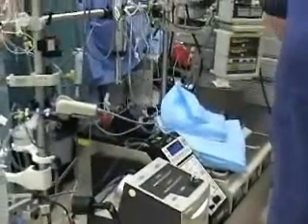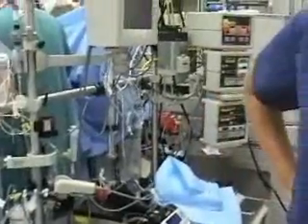With this machine, we stop the heart so he can operate on the heart while it's not moving, and then we can start it back up later in the operation, and you'll be able to see that as we're filming.